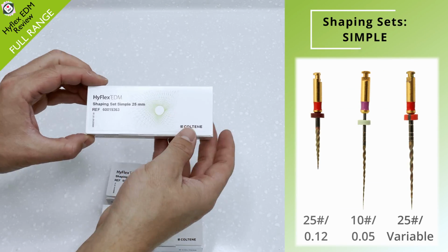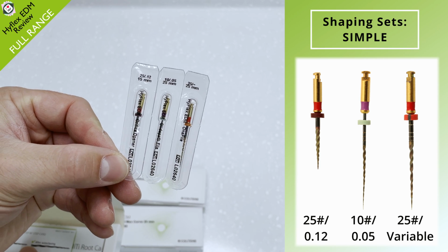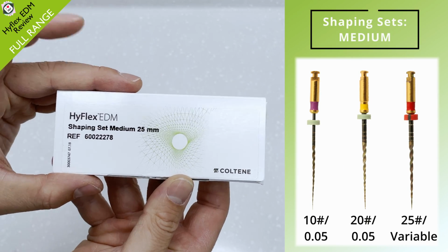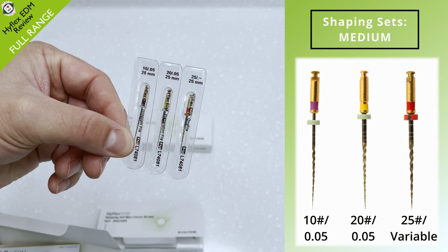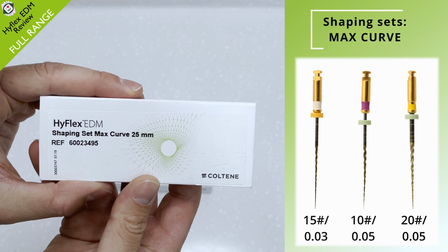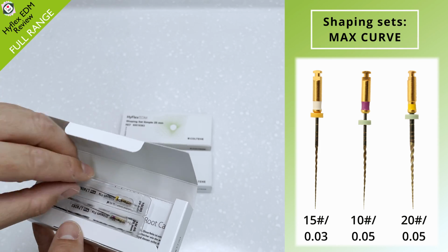The second group of files includes the shaping sets, and as mentioned before, these are packs of files that are grouped together and used specifically for a particular case difficulty level. There are 3 sets: a simple curve set of files, a medium curve, and a maximum curve set. Notice the maximum curve set has that unusual file protocol of using a size 15 before the size 10.